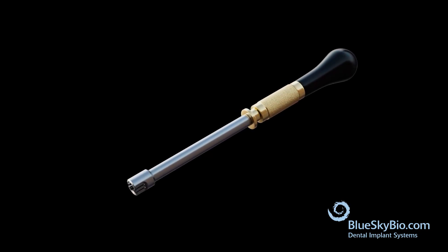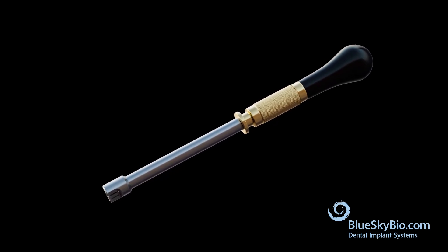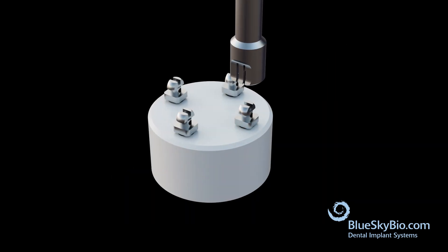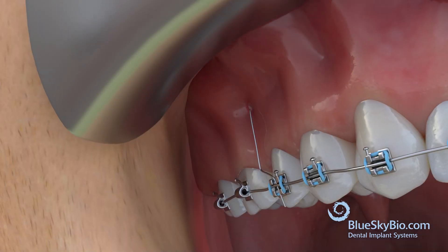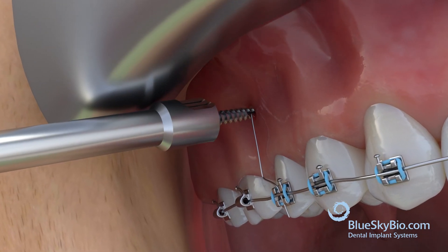Alternatively, you can use a manual screwdriver. Use the manual driver and pick a TAD out of the TAD holder. Using the manual screwdriver, manually screw the TAD into the bone.